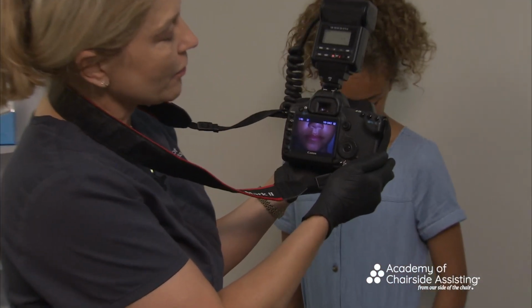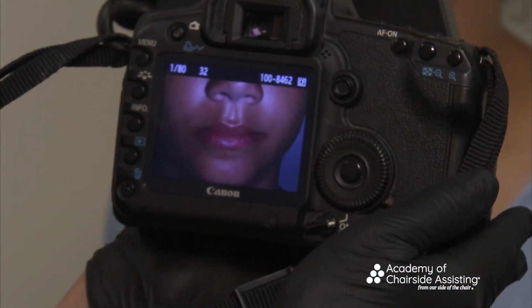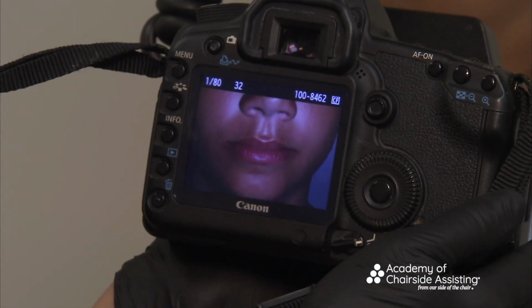So you can see here, again, same thing. A lot of these images you may not be taking, but I want to just kind of show you what's possible, and maybe there might be some that you never took before that you want to switch to.